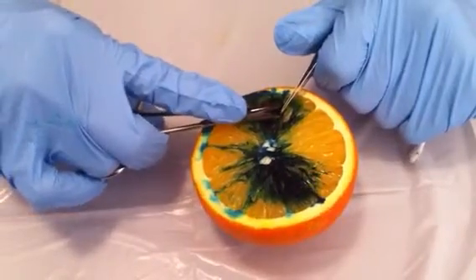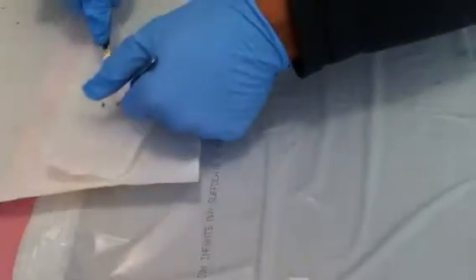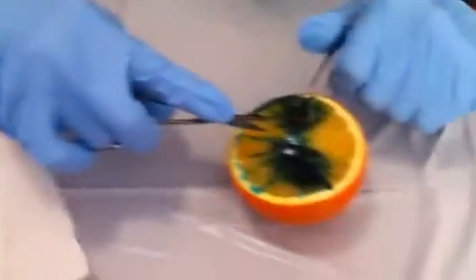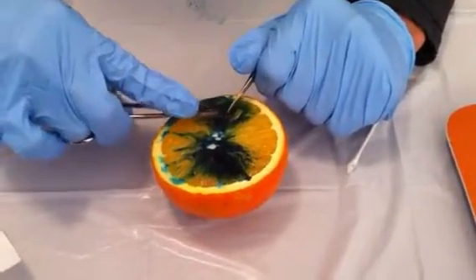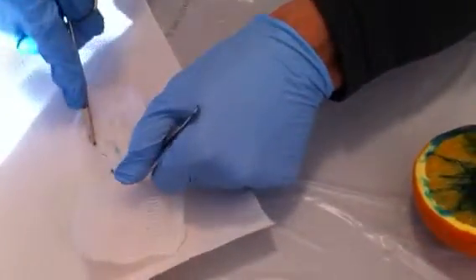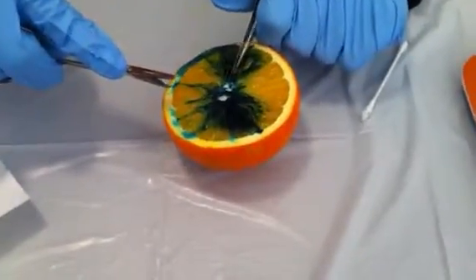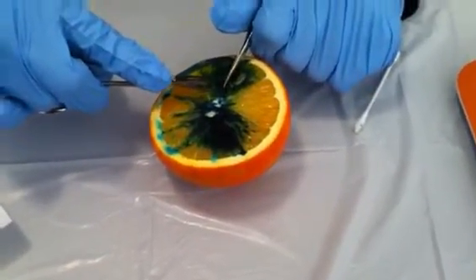I am going to keep the scissor in the upright position. I am going to cut through the middle third — and here we go.